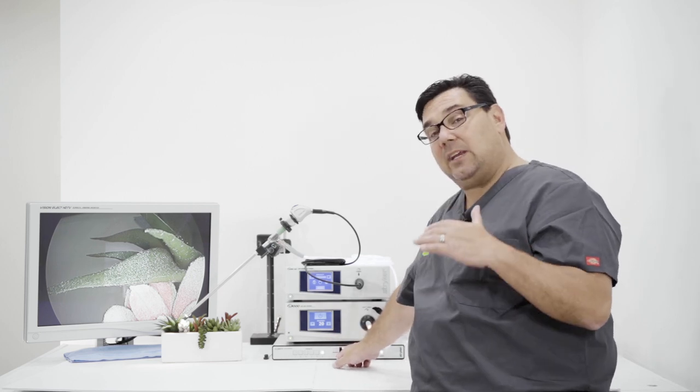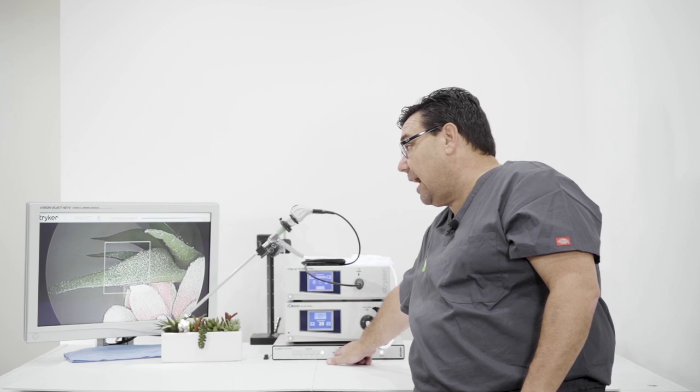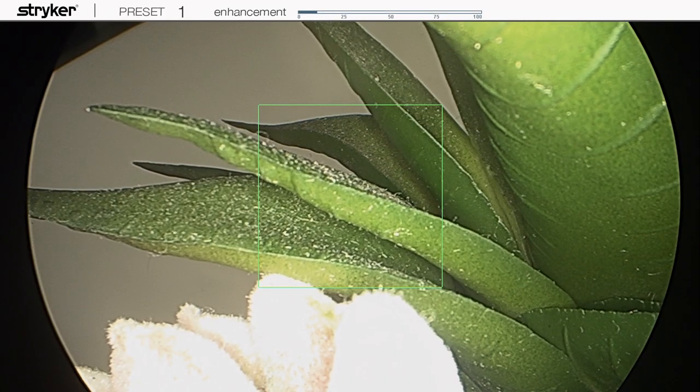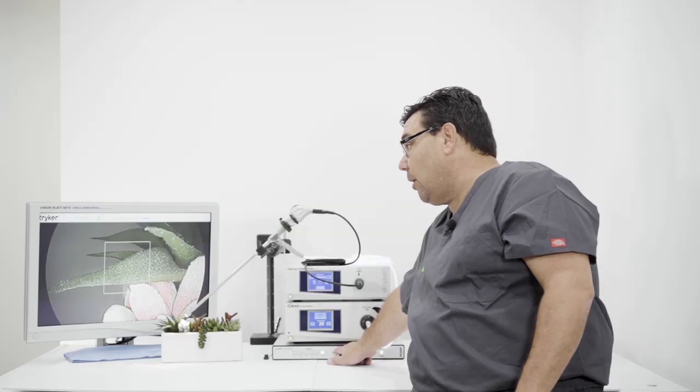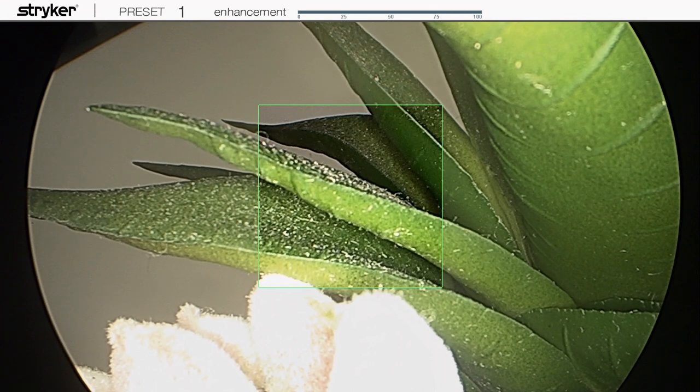If you want to turn the enhancement down, you have the ability to turn it down through the actual preset button, and it's right here. So it goes from 0 to 25 to 50 to 75 to 100.